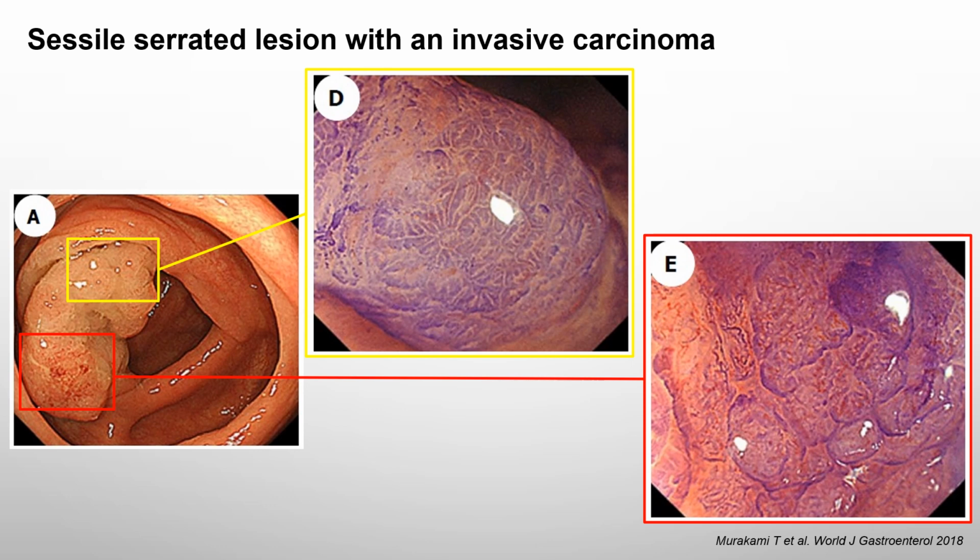We perform magnifying chromoendoscopy using crystal violet staining, a high-powered view of the marginal zone. The dilated opening of the crypt has a type 2 open pit pattern. On the other hand, a high-powered view of the middle region, in which a type 5I severe pit pattern is evident. We endoscopically diagnose the region as a carcinoma associated with an SSL and achieve an en bloc resection by performing an ESD.